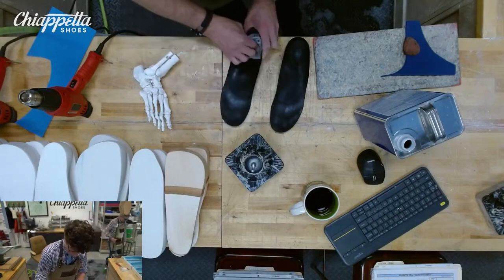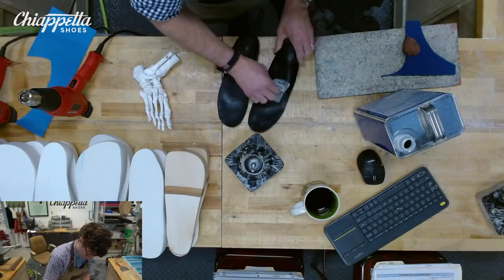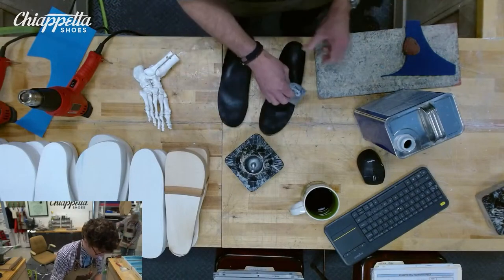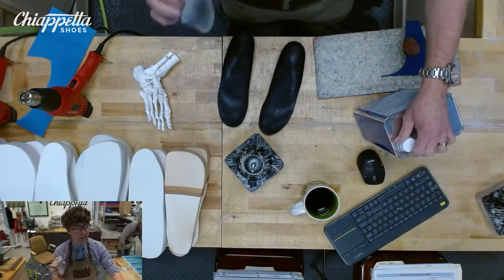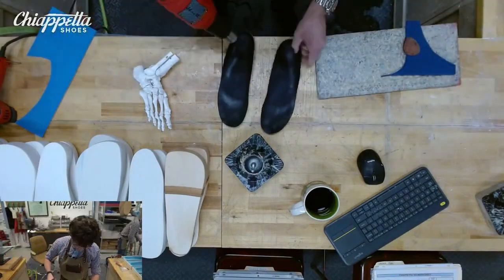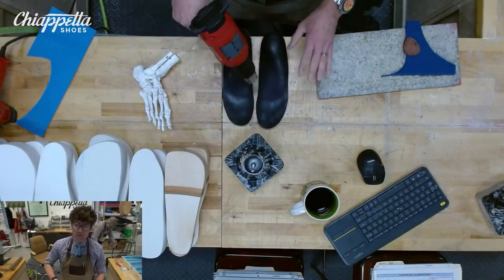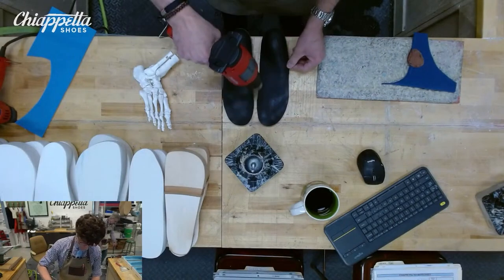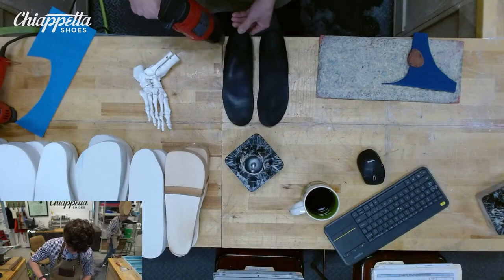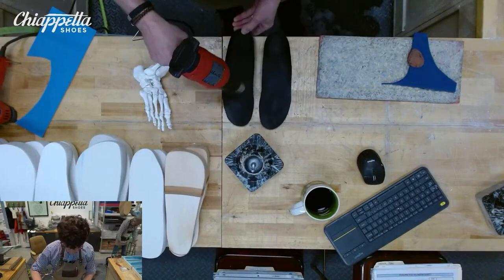Now, when we do see a change, most commonly we're going to see a change in foot types, okay? Oftentimes it's weight issues, people get larger and the arches start falling. We'll see a change in the foot type when that happens. So that's kind of our signifier if we need to switch things up a little bit. So we're going to use the old molds. Now, when we're making a new set of orthotics, it takes us about 2 weeks to manufacture new sets. She wants 2 new sets of orthotics. And with the sets, we're going to do a standard insert and then a slim insert for her dressier shoes.